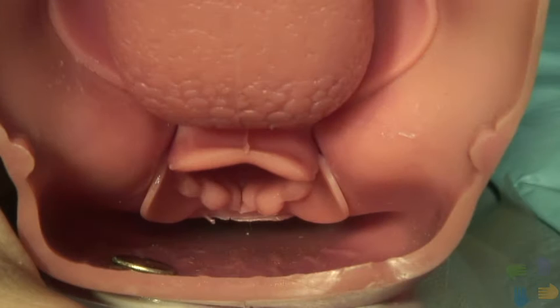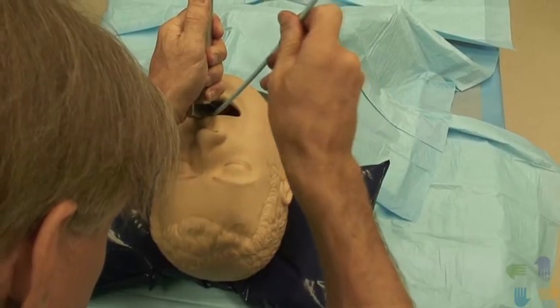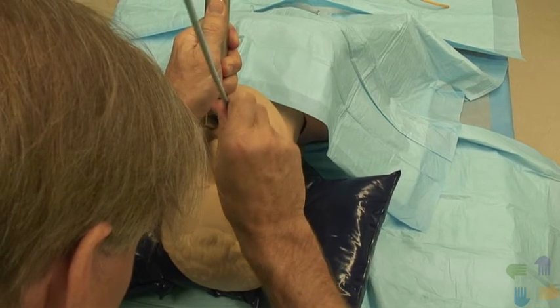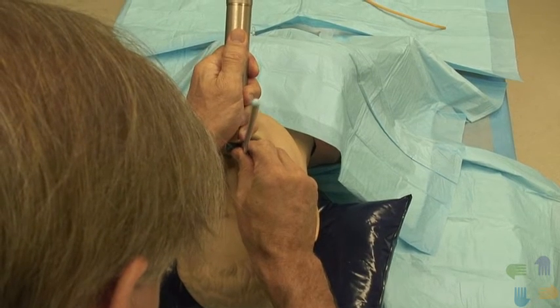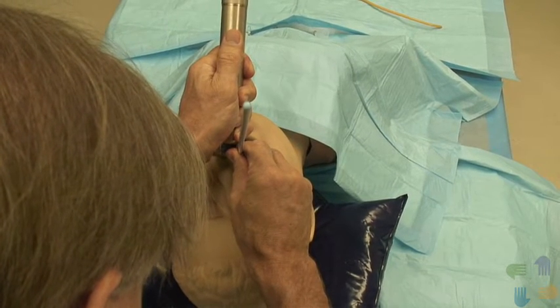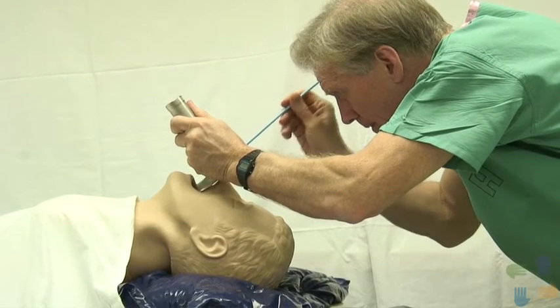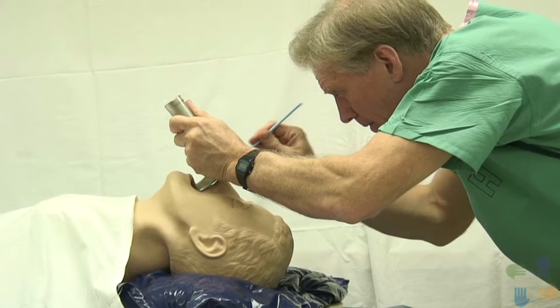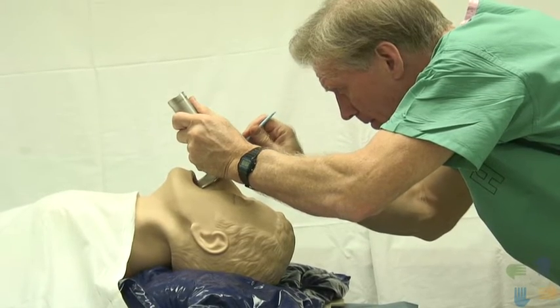If any portion of the arytenoids, the most posterior aspect of the laryngeal inlet, can be seen, placing the bougie just anterior to them and in the midline will guarantee correct endotracheal placement. Usually when you pass the bougie into the trachea, you'll feel the click of the tracheal rings as the angled tip strikes against them, confirming tracheal placement. If you're unable to visualize any portion of the laryngeal inlet, confirmation of correct bougie placement must be non-visual, either by feeling the tracheal rings or advancing the bougie to 40 centimeters, at which point there should be some resistance as it encounters the carina, or twists as it enters one of the main bronchi.